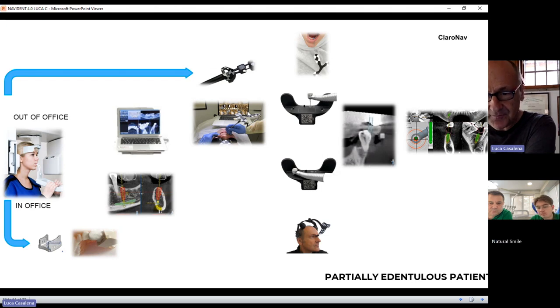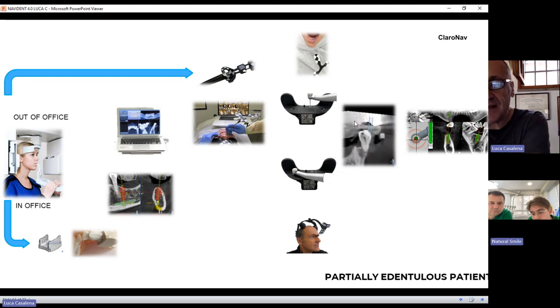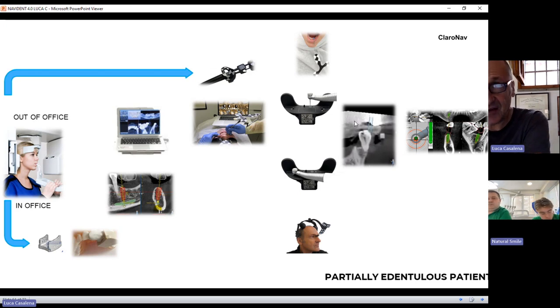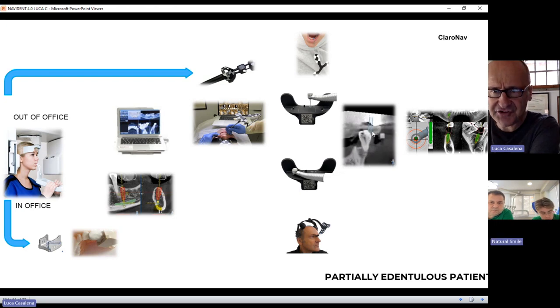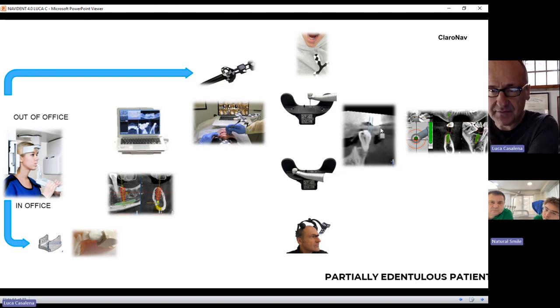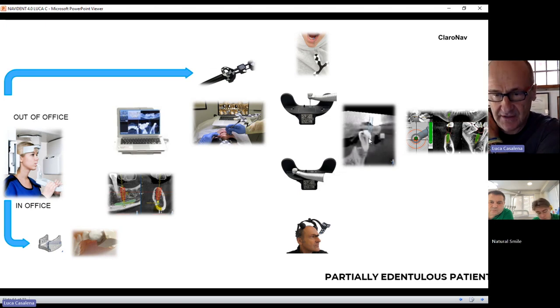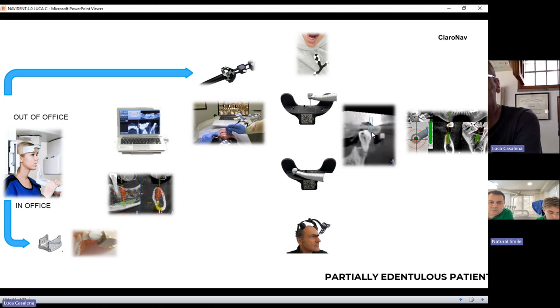The test shows whether you've done a good job or a bad job; you cannot assess the quality by yourself. The accuracy check is simply touching with any tip — in this case a tracer tip or a cusp — the surface of a tooth, and you should see the same cusp touched on the laptop screen. There should be congruency between what you do and what you see. If there is congruency, it means the system is set.